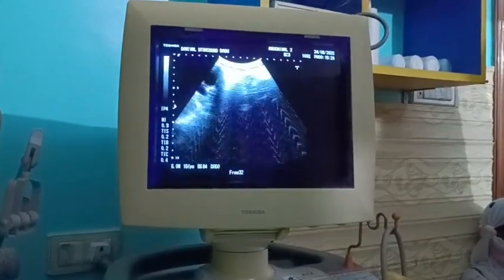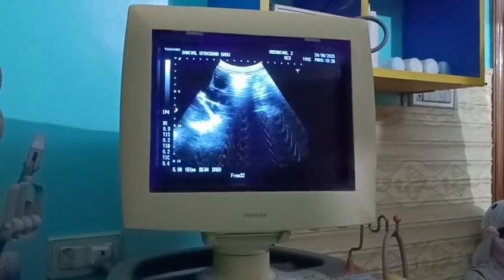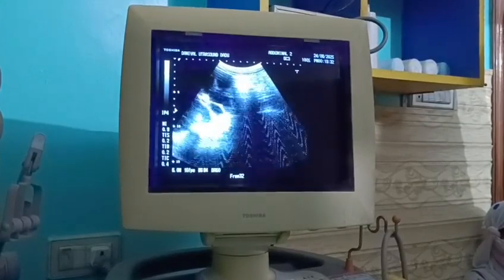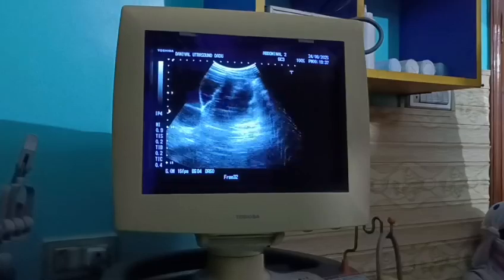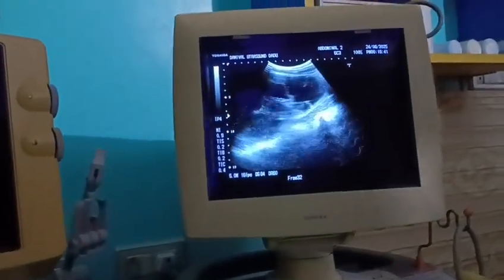And the fourth, not the last but not least, is that severely dilated calyces, if you trace them, will definitely open up into the renal pelvis. So these are important.